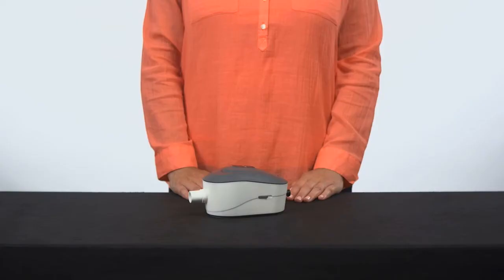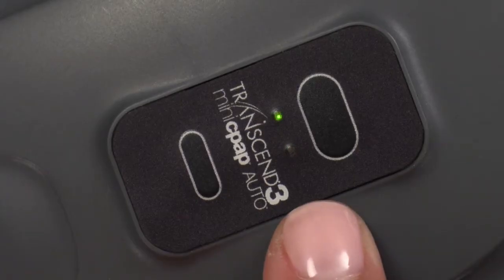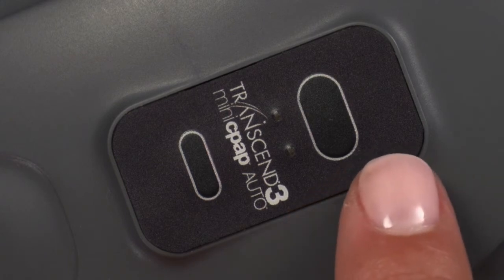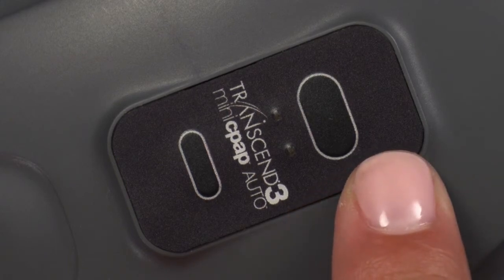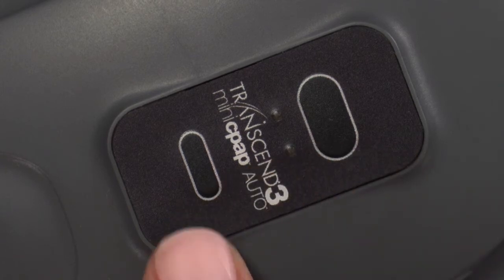Turning the device on is easy. To begin, plug in your Transcend 3 miniCPAP. The LED lights will flash, then turn off, signaling the CPAP is ready. Press the large button on top to begin therapy. Then press the smaller button below it to enable the ramp feature once the CPAP is in operation.